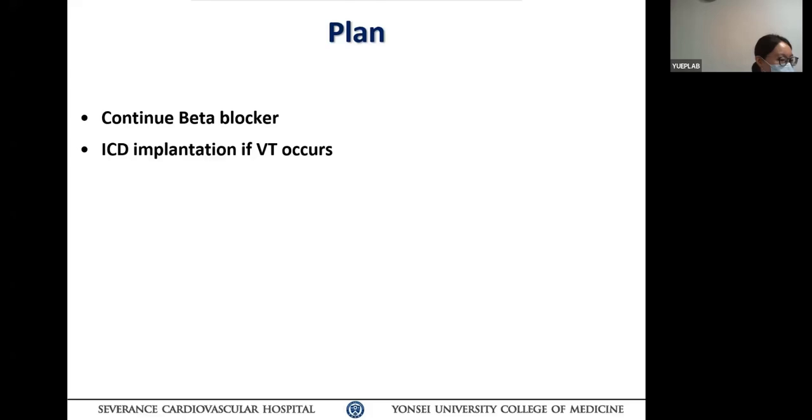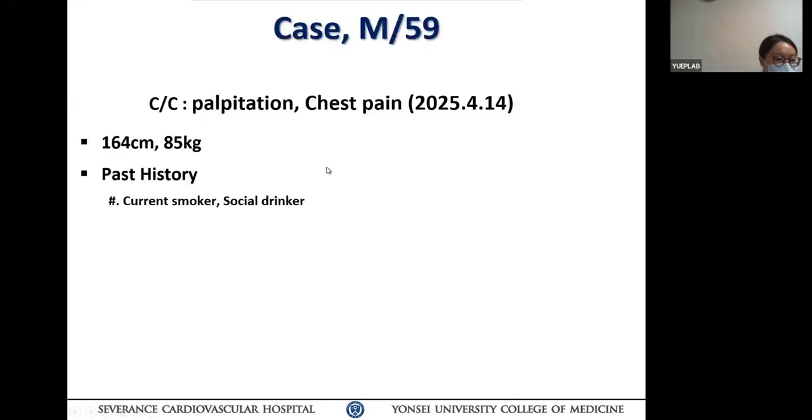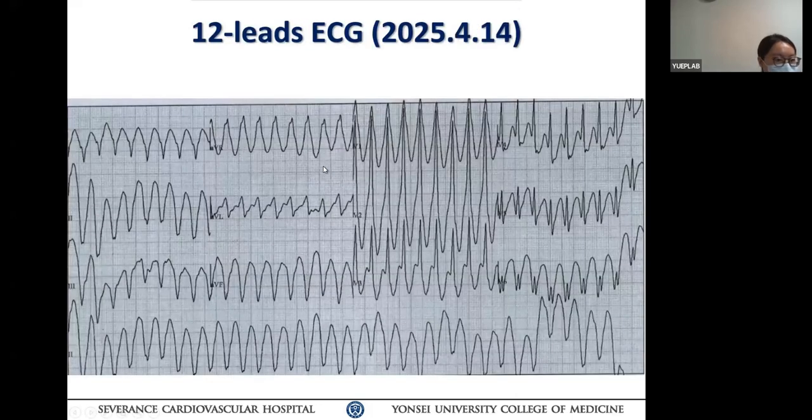Okay. But if the diagnosis is correct, that it is a papillary muscle, you're assuming focal VT. And that may explain why it is a slightly irregular VT, not a monomorphic regular VT. That may favor focal VT. If you look at your clinical presentation, you see somebody rather regular, but it's slightly irregular. Do you see it? Especially in AVL. Take a look at it. So there is some acceleration and deceleration going back and forth. But that could also be fusion from the upper. So those things, especially in V6, you can see the acceleration and slowing down a little bit too. So this favors focal VT, but then again.